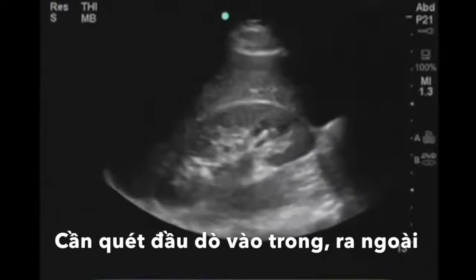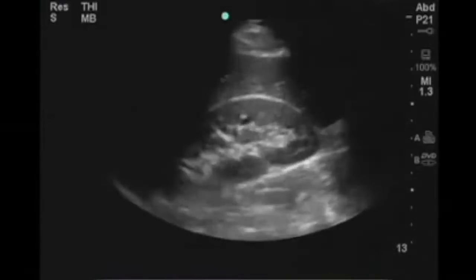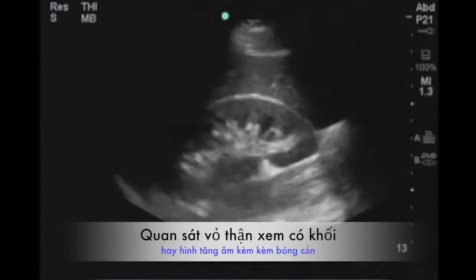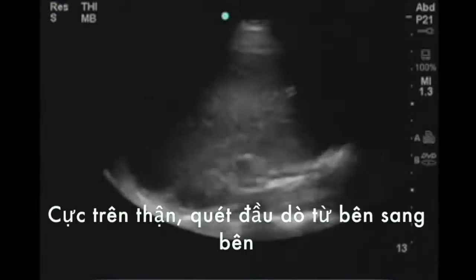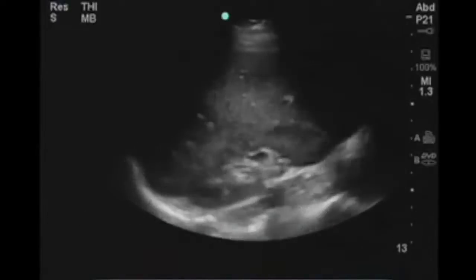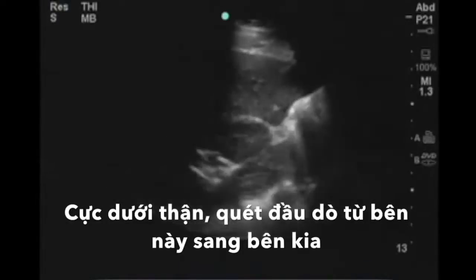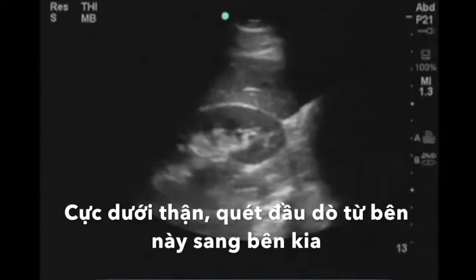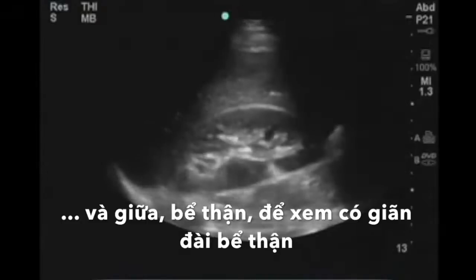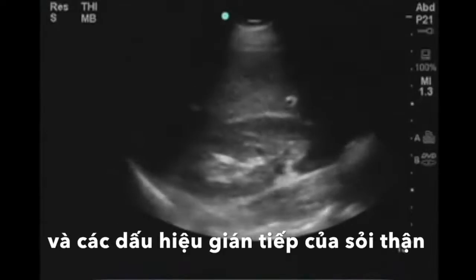What I want to do is evaluate in a long view, sweeping medially and laterally, looking at the cortex to determine if there are any echogenic or bright shadowing stones. So I can evaluate the superior pole, sweep from side to side, and look at the inferior pole, sweep from side to side, and look in the mid pelvis area of the kidney to determine if there's hydronephrosis, an indirect sign of nephrolithiasis.